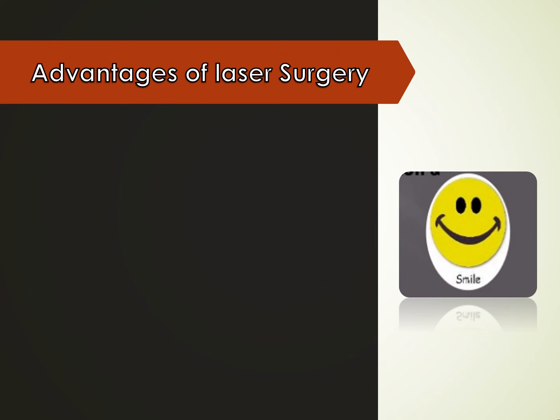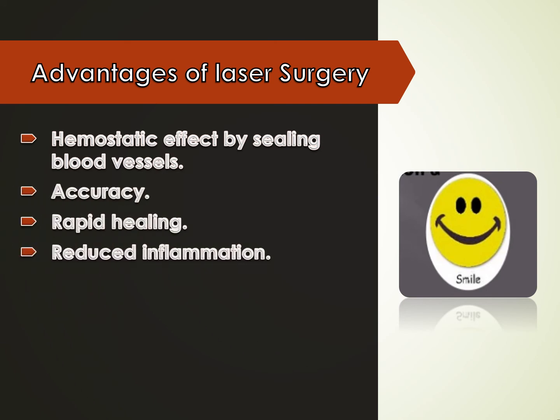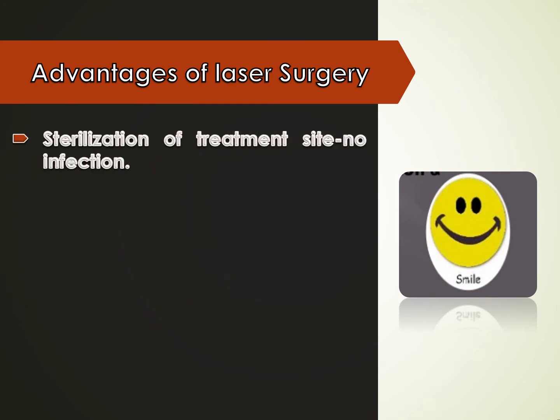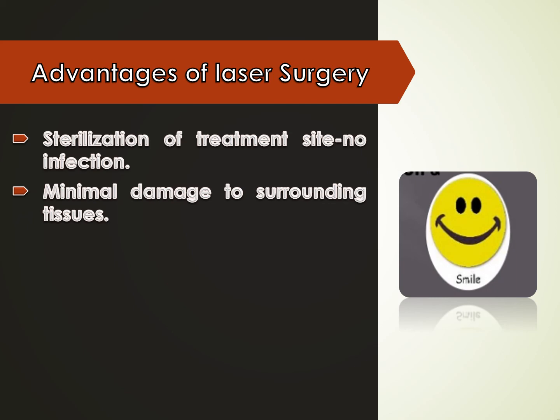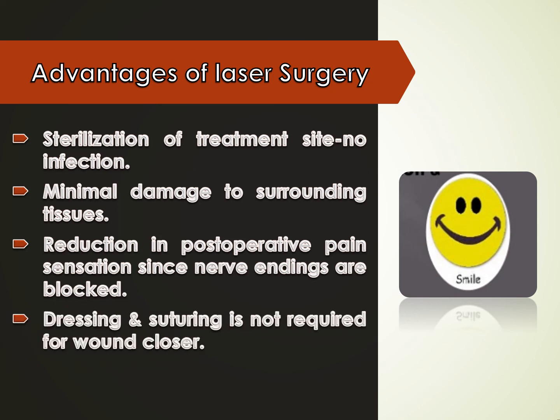Advantages of laser surgery: hemostatic effect by sealing blood vessels, accuracy, rapid healing, reduces inflammation, little post-operative scarring, low level of discomfort, reduces post-operative edema, sterilization of the treatment site, no infection, minimal damage to the surrounding tissue, reduction in the post-operative pain sensation since the nerve endings are blocked, dressing and suturing are not required for wound closure, and operating time is reduced.